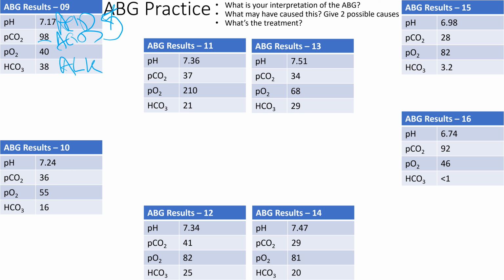Like a severe pneumonia, like that PO2 is 40. That's not good. Someone's not breathing, right? It could be just someone that's found down, someone has a stroke, and they're down and no one checked on them. And someone did check on them in time, and now the ambulance came, and they did an ABG at the ER, and they found the PO2 so low because they were not breathing, right?